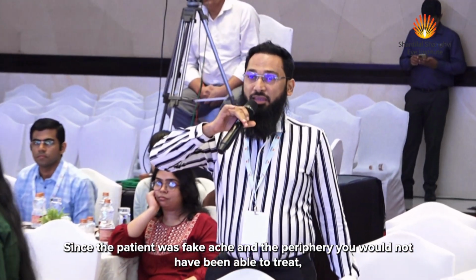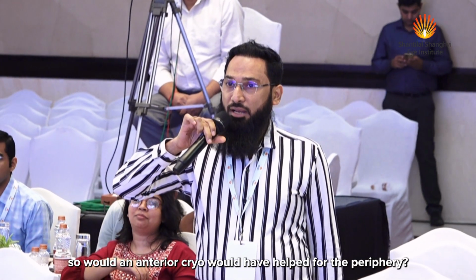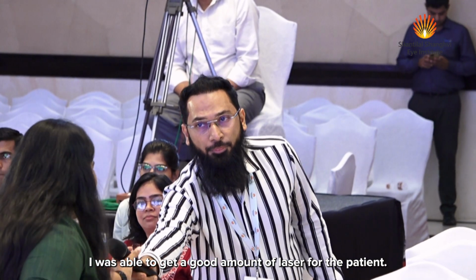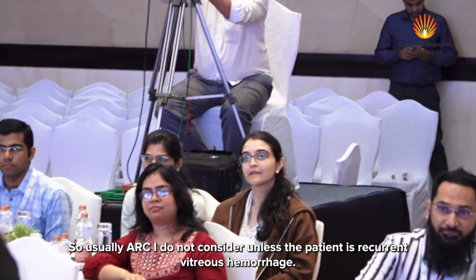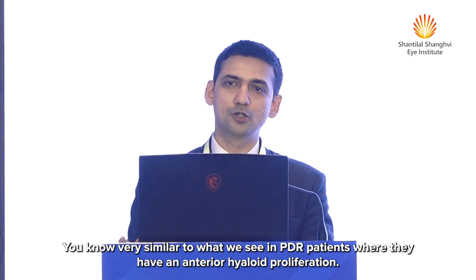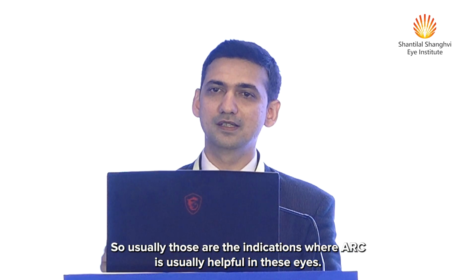Since the patient was phakic and you wouldn't have been able to treat the periphery, would an anterior cryo have helped for the periphery? I was able to get a good amount of laser for the patient. So usually I do not consider ARC unless the patient has recurrent vitreous hemorrhage, very similar to what we see in PDR patients where they have an anterior hyaloid proliferation. Those are usually the indications where ARC is helpful in these eyes.